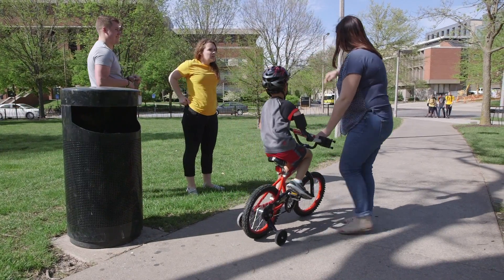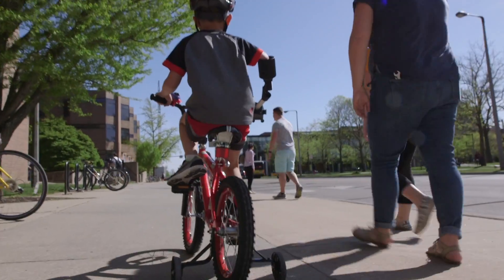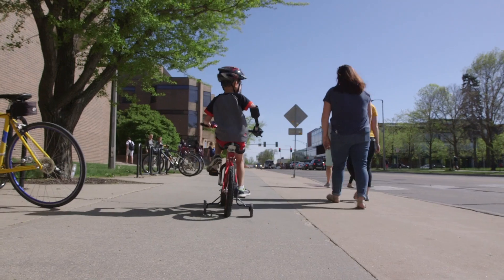They started working with Johnny to help him ride his bike better, and then also as prototypes were developed, to help him use the prototype — it's just been a great experience. We realized that it wasn't just a device; we'd have to work with him to give him the skills it takes to be able to balance and control the handlebars.